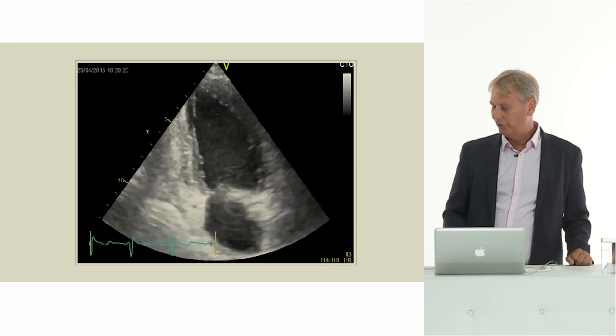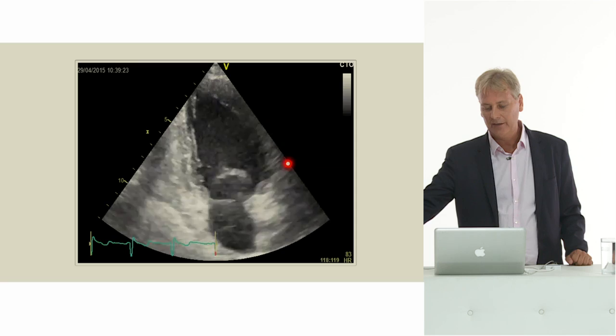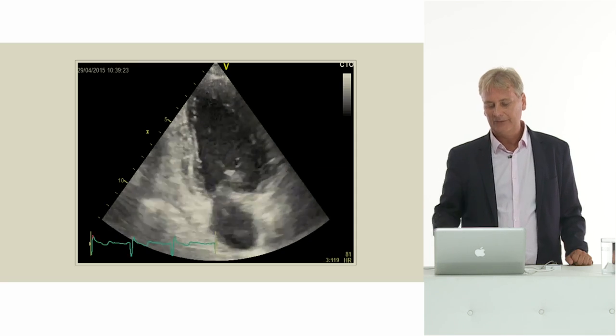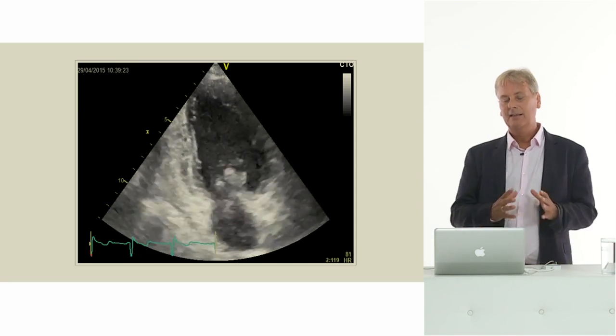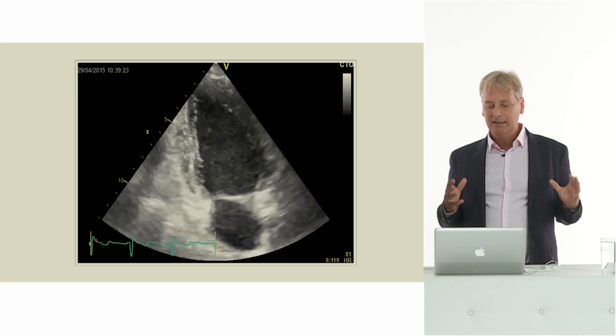I was hoping I would show it here, but one thing you should be aware of is the left atrial appendage, which is not visible in this patient, but would be seen somewhere here. It can also indicate elevated filling pressures, because you would see large, expanded left atrial appendages in such patients. But it's a clear statement to exclude it in the measurement. If you measure the size of the left atrium, you have to exclude the left atrial appendage and, of course, the pulmonary veins.